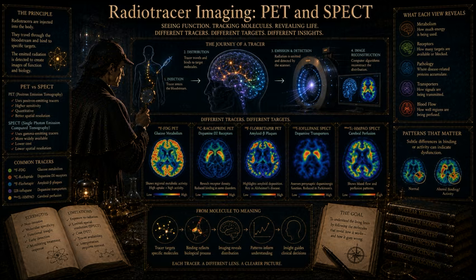Okay, 1 centimeter and 19 centimeters. Now imagine the event happens directly in the center of the brain. The left-facing photon travels 10 centimeters, and the right-facing photon travels 10 centimeters. Okay, I follow the geometry, but how does that help?